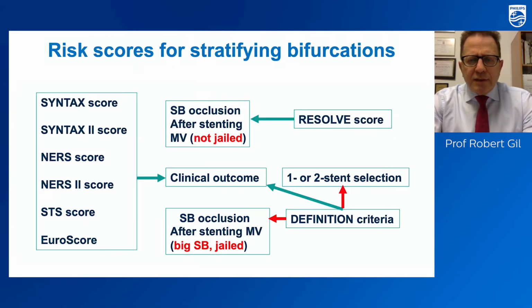If you look here, this RESOLVE score helps us to assess whether one stent is enough or not. But the definition criteria, which are becoming more and more popular right now, tell us whether a lesion is complex or not.